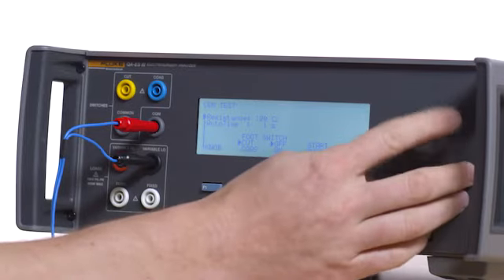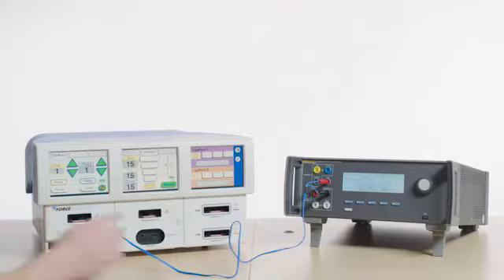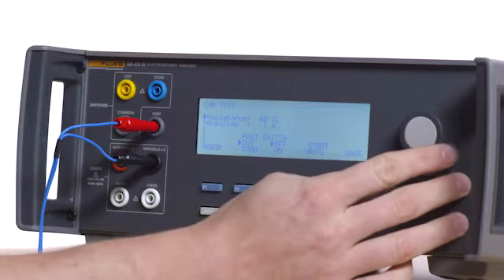Decrease resistance to 60 ohms and once again confirm the REM indicator is green. Increase the resistance to 77 ohms.